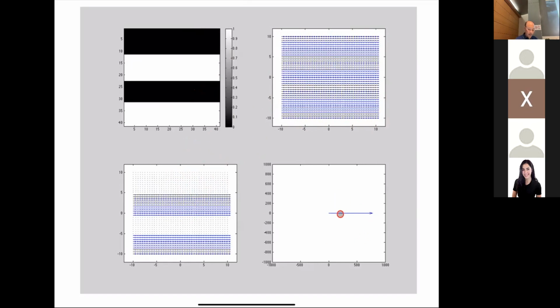And then this is the summation of all these spins. So that's the vector sum of all these things. You can't really see it here, but all these spins are aligned. So we're starting off at kx equals 0, ky equals 0. And you can see at that pattern, there's still a pretty good summation of spins because all these line up, right? That's just saying that's the center of K space. That's just saying, hey, there are protons there, right? So those still sum up, okay?